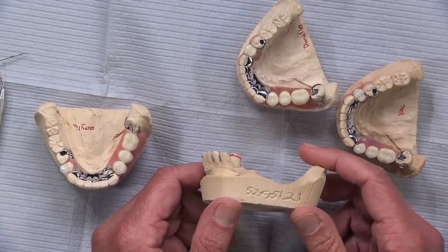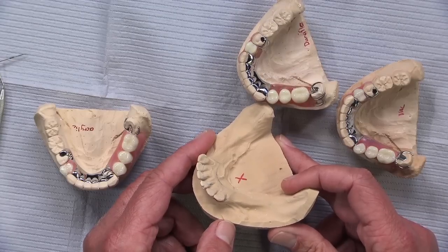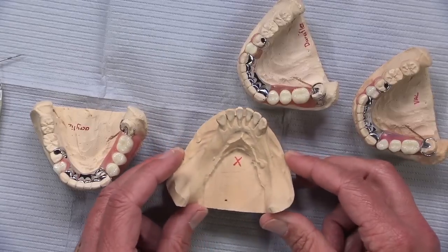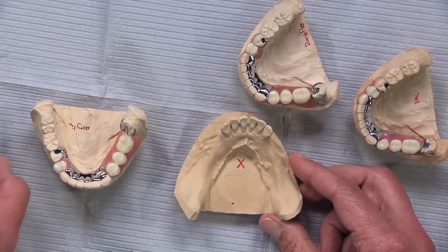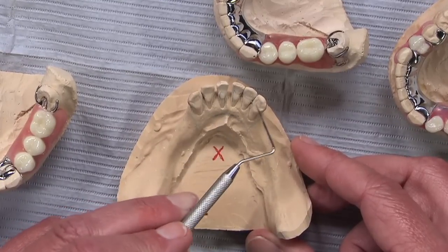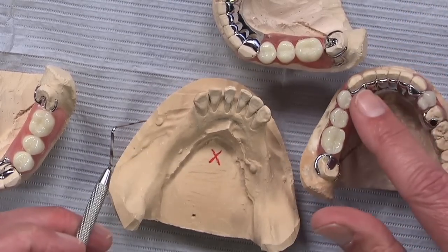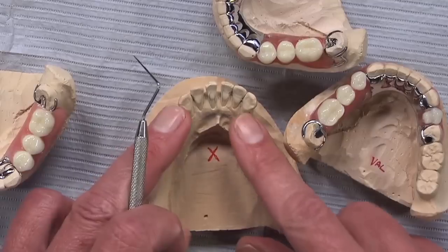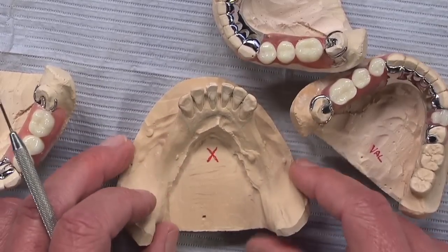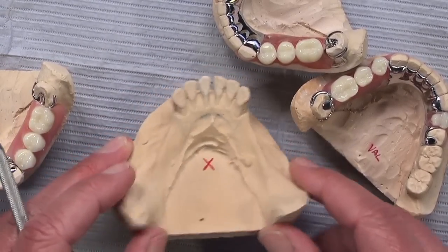So anytime you've got that height of contour and it's so high up on the tooth, as you can see there, that's when we start looking for an eye bar itself. And this is a case, just in terms of one other thing, where if the dentist had prepped, let's say, a cingulum rest here and a cingulum rest here, all of a sudden we could have done the metal apron like this with a couple of rests, and we have a much better chance of when the patient functioned on this denture that it wasn't digging into the tissue and just driving them crazy and knocking the gingiva down next to the cuspids as well.